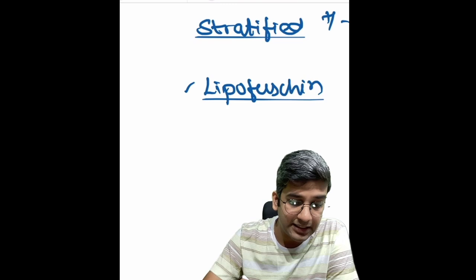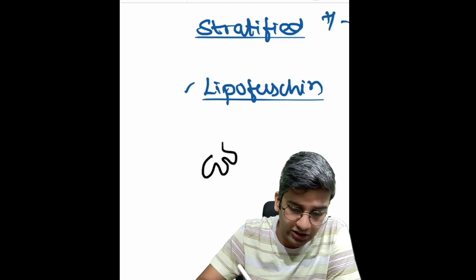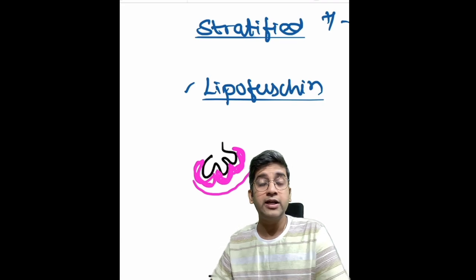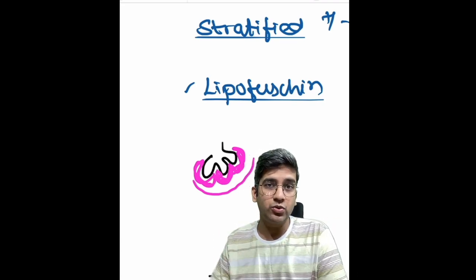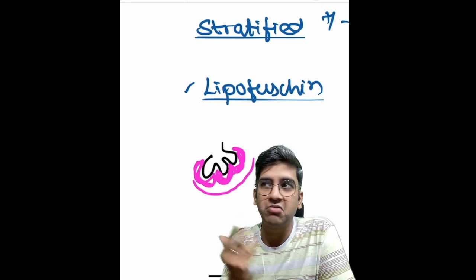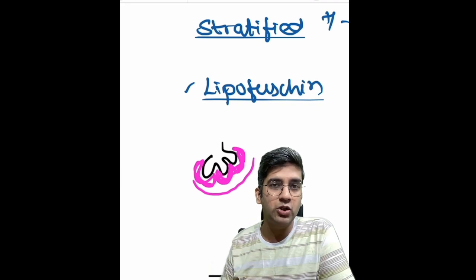Seminal vesicle surrounding the gland, let's say this is a gland, you'll have a very thick inner circular muscular coat. Surrounding it, you can have a little bit of a thin longitudinal external muscular coat also, right? So actually the seminal vesicle looks like it's embedded in the muscle coat. That's how the normal seminal vesicle is, very thick wall and a very thin lumen, similar to what you see in a tube, right? Very thin lumen and a very thick wall. That's how the seminal vesicle looks.